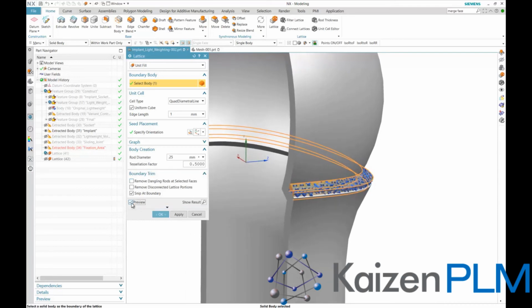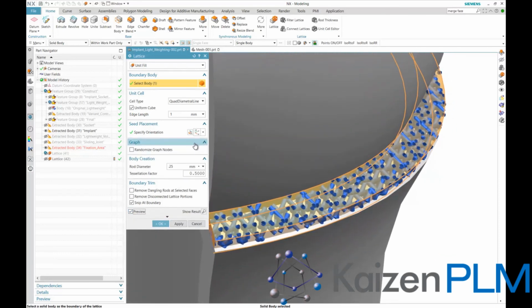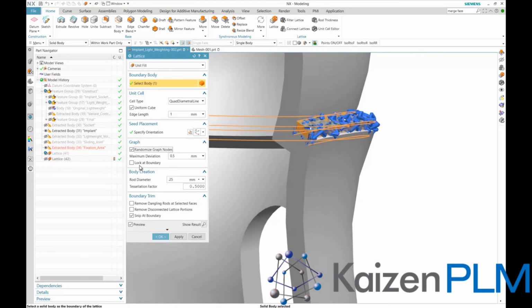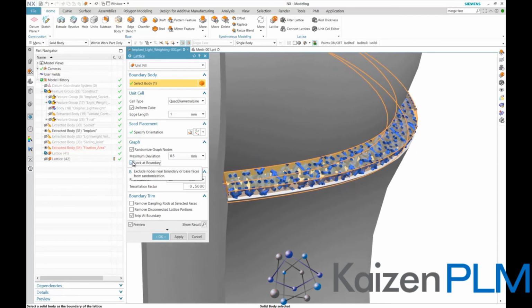The preview provides a good overview of the results, and we see that the required lattice pattern is shown. By turning on randomized graph nodes, we assess if the provided result is a good lattice for the fixation purpose. The randomization takes place inside the volume. However, the lattice nodes might appear outside as it is the last vertex in the volume. By using lock boundary, you can exclude the randomization near the boundary where you will get a normal pattern of your lattice.